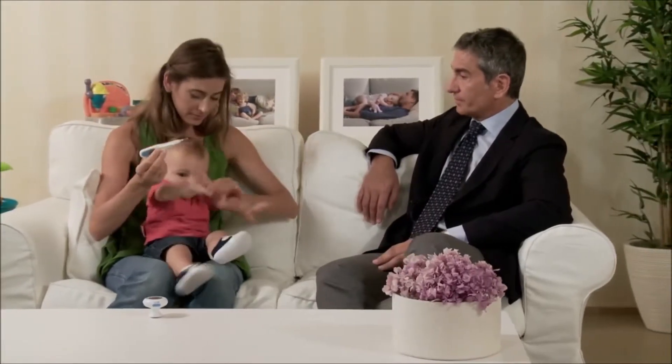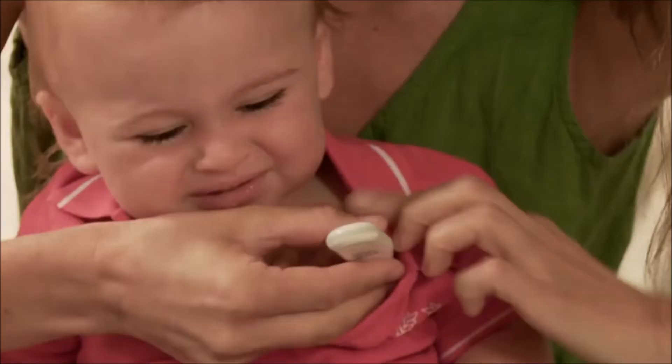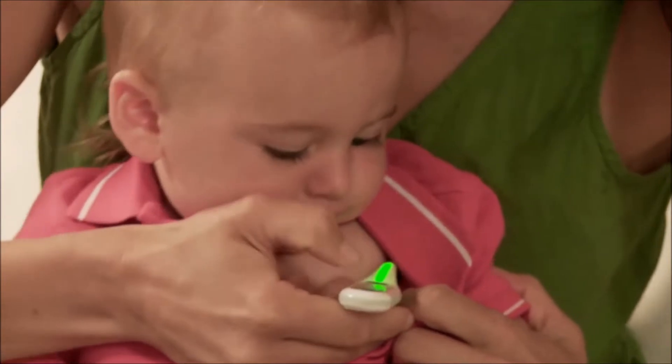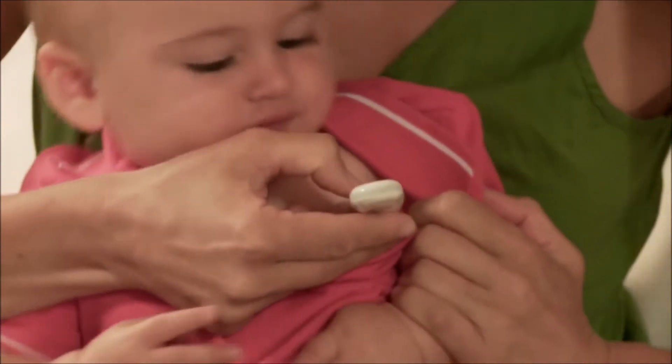Can I try? Sure. It's easy — so flat and easy to read. Yes, that's perfect.